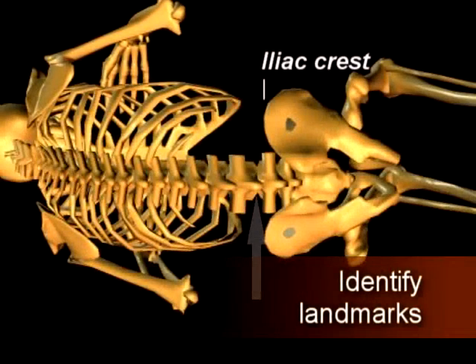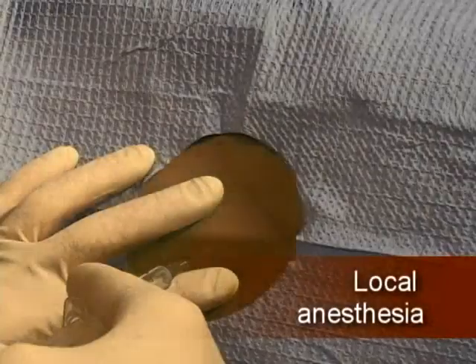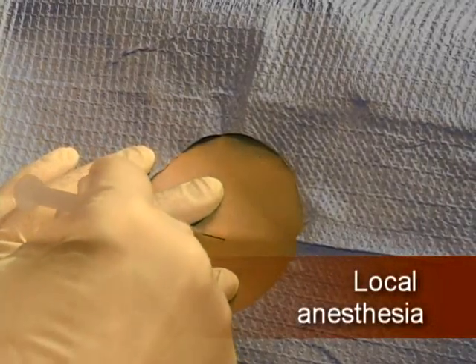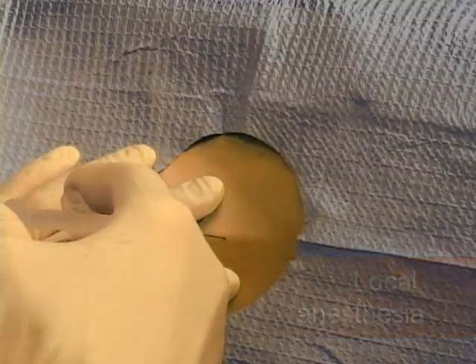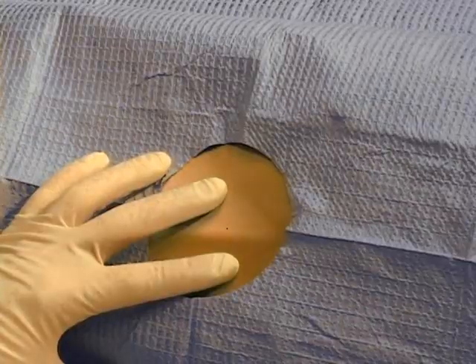The iliac crest serves as the landmark that marks the interspace between the third and fourth lumbar vertebrae. Place a fenestrated drape over this space after it is marked. Anesthetize the skin and deep connective tissue with 1% lidocaine.